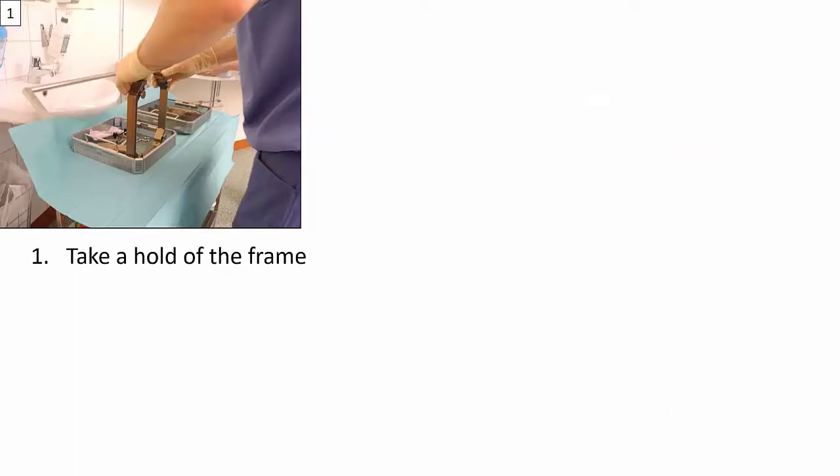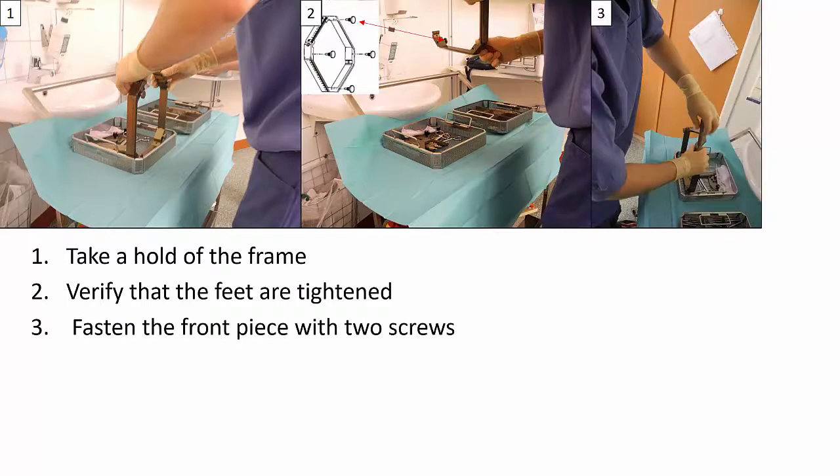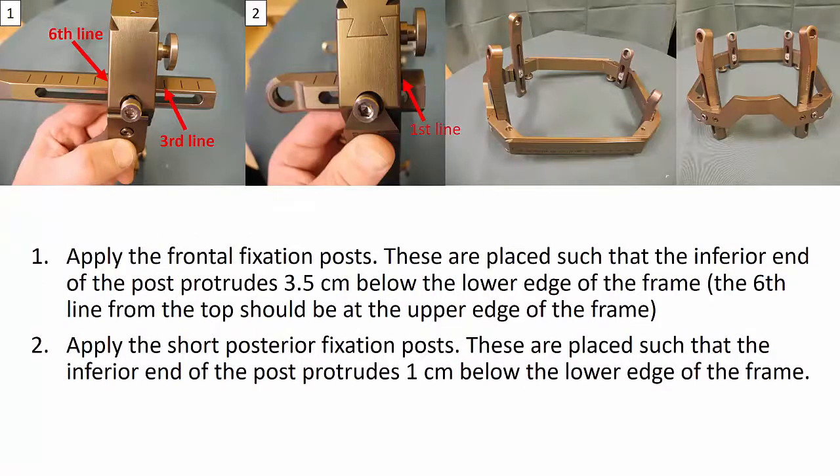When assembling the frame, start by taking hold of the frame, verify that the feet are tightened, and fasten the front piece with two screws. When fastening the front piece, the phrase 'feet down and nose up' will help you remember how to position the front piece. We then apply the frontal fixation posts. These are placed such that the inferior end of the post protrudes about 3.5 cm below the lower edge of the frame.